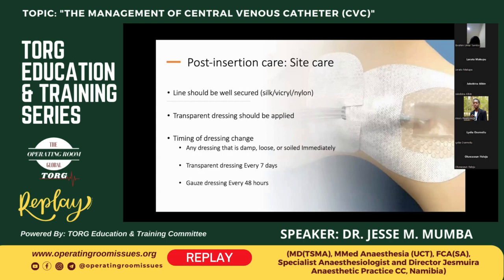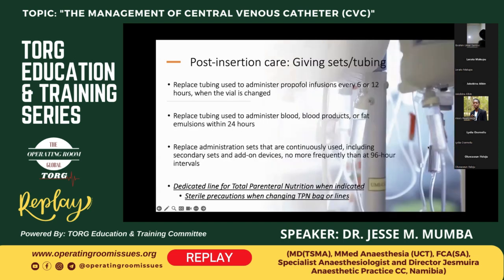Continuing on the post-insertion care, so how do we make sure that this line is secured? We recommend that you always suture your central line and you apply a transparent dressing, and then this dressing should be changed every time it's damp or soiled. And for those that have access to this type of dressing with a nice jelly pad that's antimicrobial, you can change them every 7 days if it's not soiled or damp. But if you are using the gauze type of dressing, you should at least change every 48 hours.